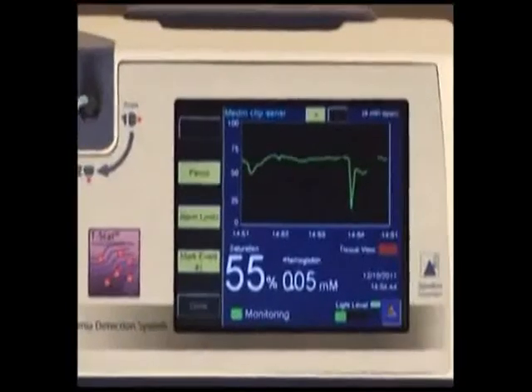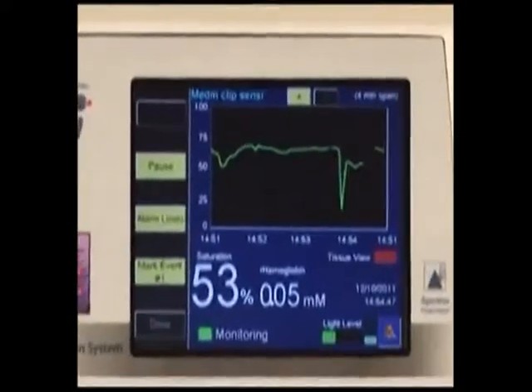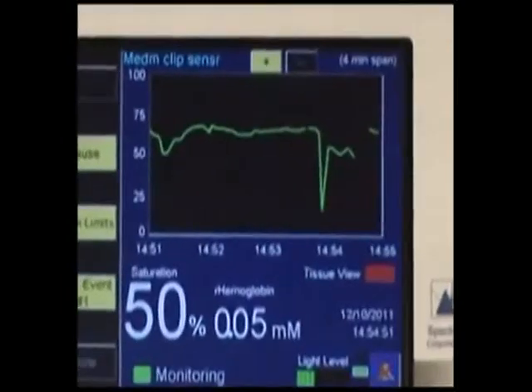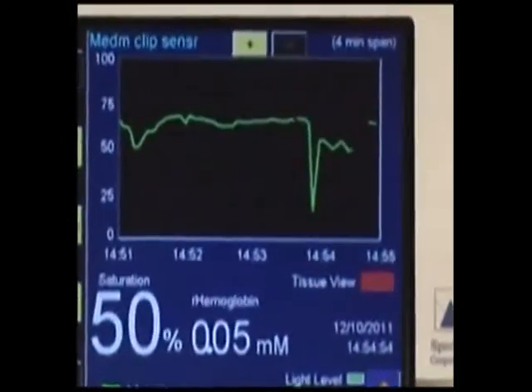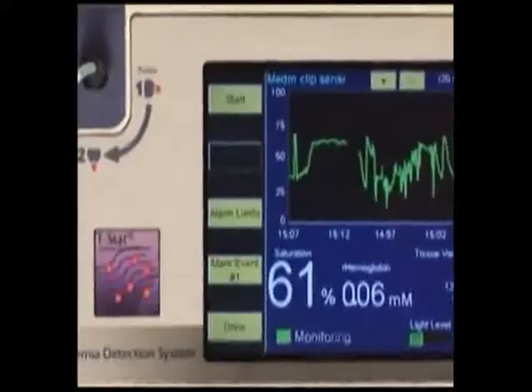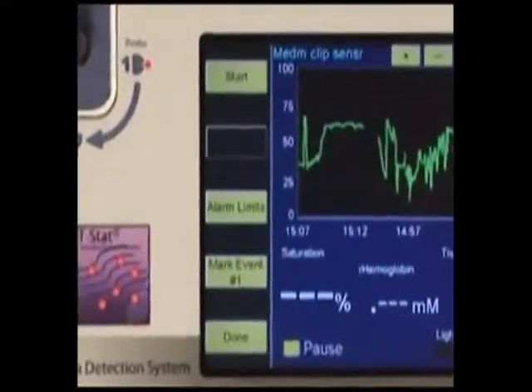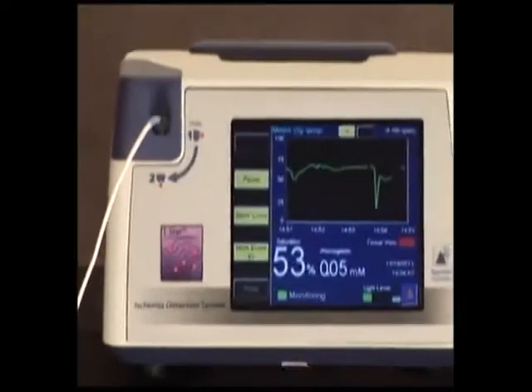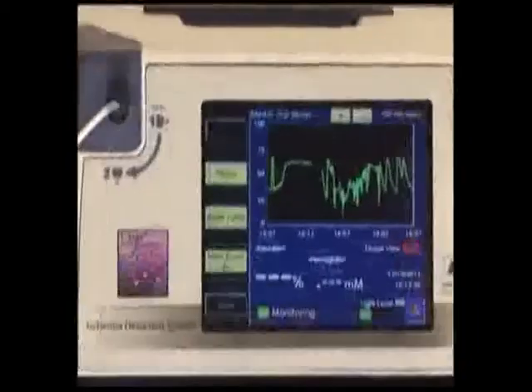There are two options when pausing or stopping the monitoring. If you want to pause monitoring but keep the trend data in Monitor and resume monitoring later, then press Pause. Pause will appear in the lower screen. This allows sensors to be repositioned or the patient to leave the bed without alarming. Probes should not be changed while paused.